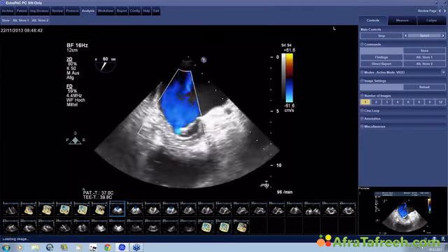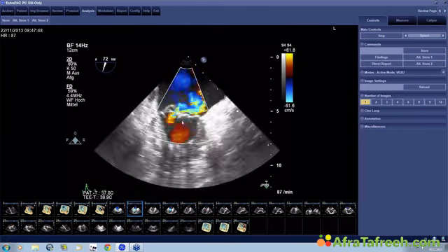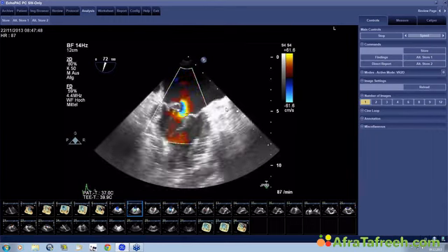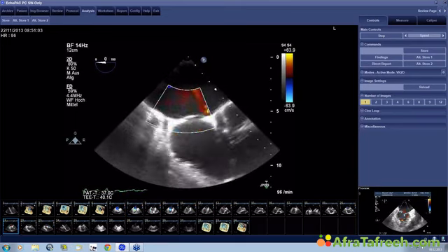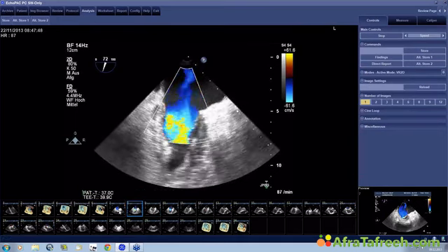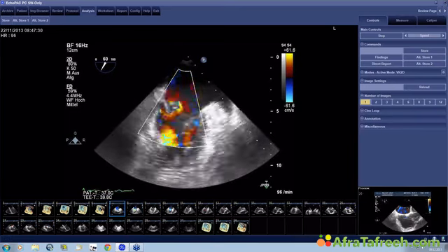And just to show you the severity of mitral regurgitation, to conclude the case, yes, I would say it is severe. You have a lot of flow convergence, and so on. It's not severe, it's probably moderate to severe, I would say. And certainly this is a patient that you'd have to follow up and see if the ventricle starts to deteriorate or dilate, or the patient gets symptoms.